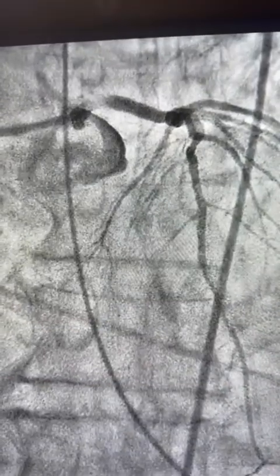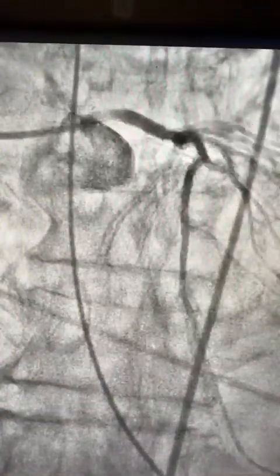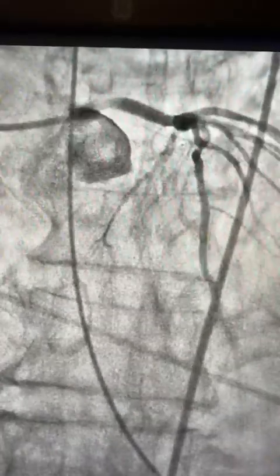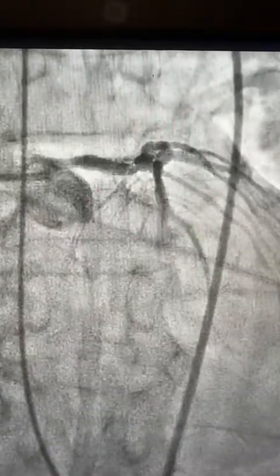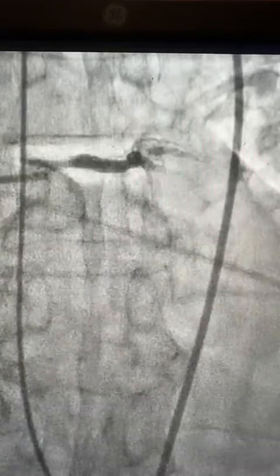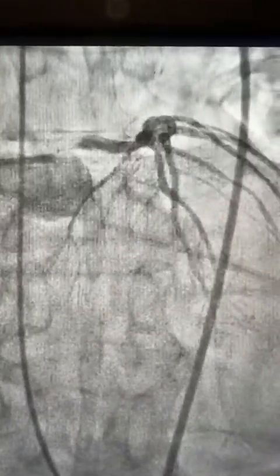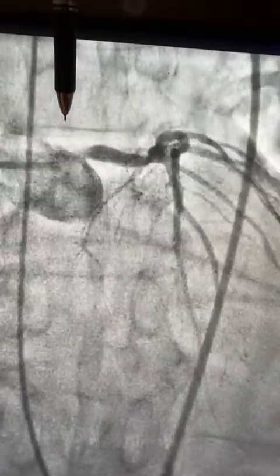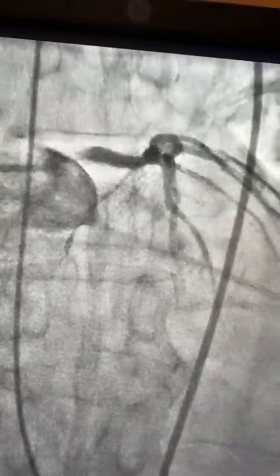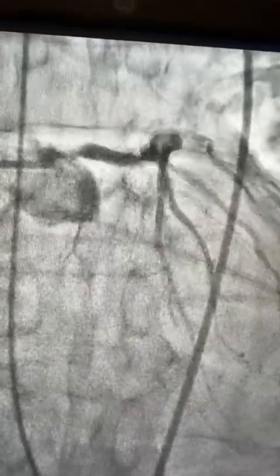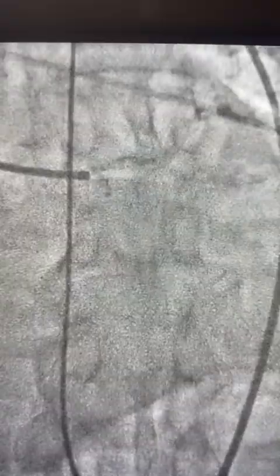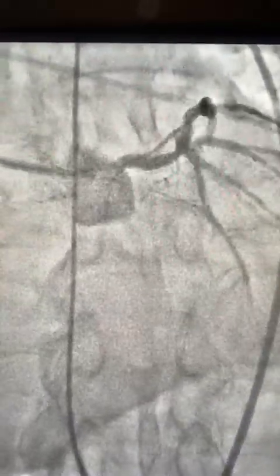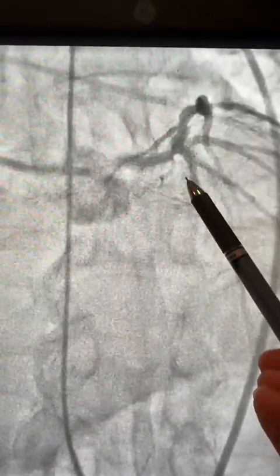Here is the AP view. There is an ostial lesion in the left main, heavily calcified. Here is the caudal view — see multiple branches. There is a stable lesion distally.